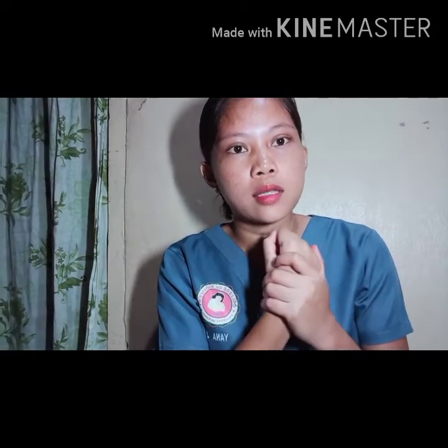So firstly ay is pangutan ni mga patient kung asa iyang dominant hand.